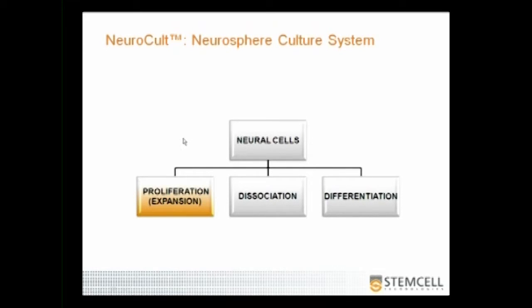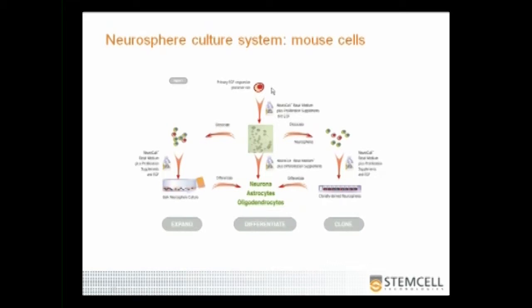The Neurosphere culture system has been a valuable system for the large-scale expansion of neural precursor cells. Here I will describe some of the major technical details that need to be observed when working with neurospheres. Once tissue is dissected from the embryonic or adult brain, the tissue has to be dissociated using mechanical and/or enzymatic means into a single cell suspension. Shown in the slide are the media and protocols we have developed to obtain consistent and robust neurosphere cultures.